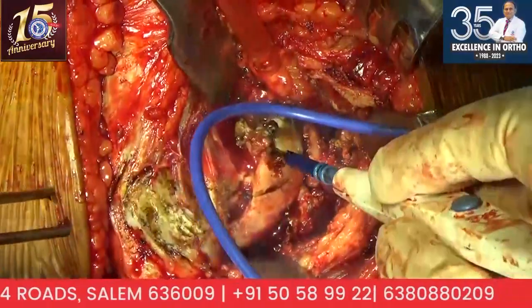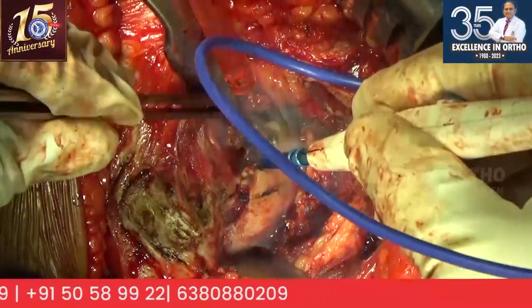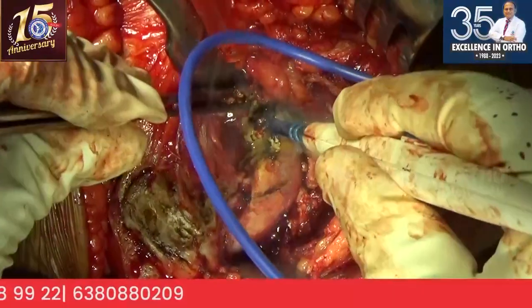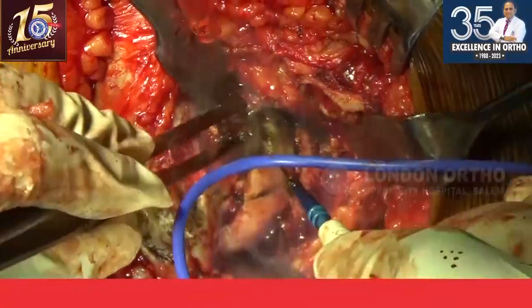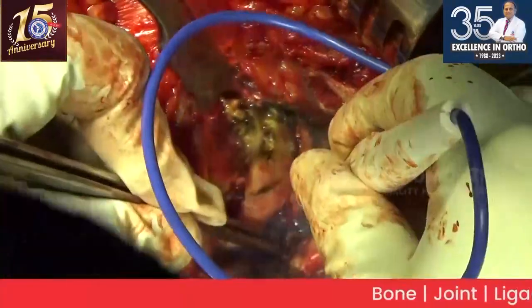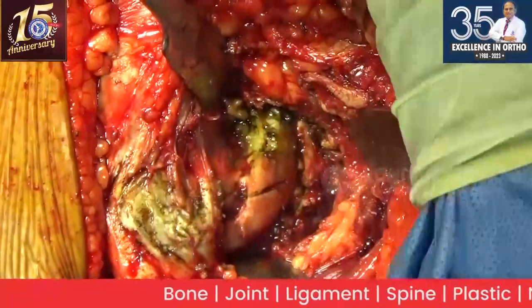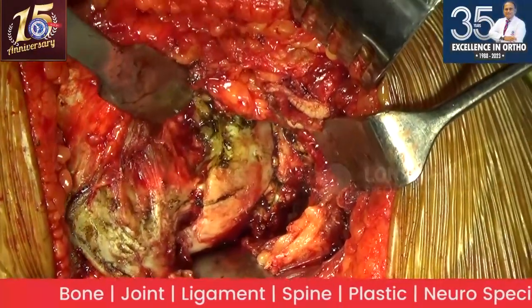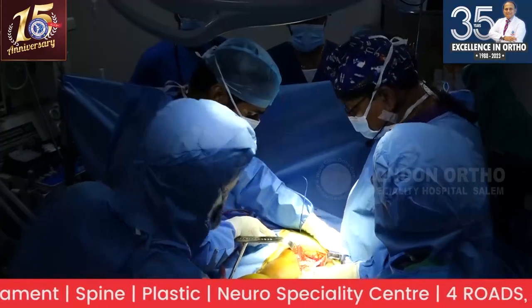So that's a protuberant osteophyte on the femoral side. If you have difficulty, you can remove it and then dislocate it. But I think I should be able to dislocate it. See, I have not removed much tissue, it's all more incision. We'll try to dislocate without removing it. Traction. That's right. Here it's coming. Okay, good.